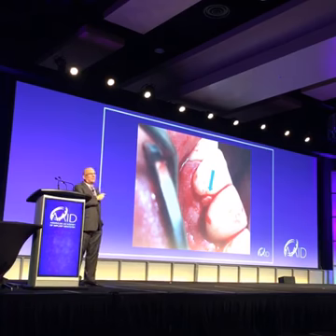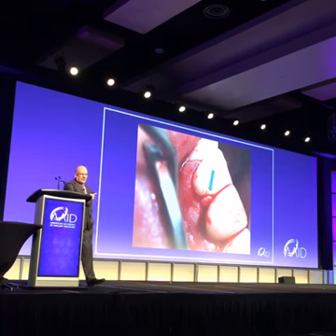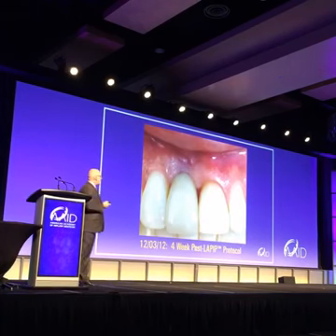Here's the initial cause of what happened: he had the cementitis that I talked about. He had a cementoma, if you want to call it that. It opened the tissue up and allowed the bacteria to get in. So we ended up cleaning off the excess cement. Here's what it looked like 4 weeks later.